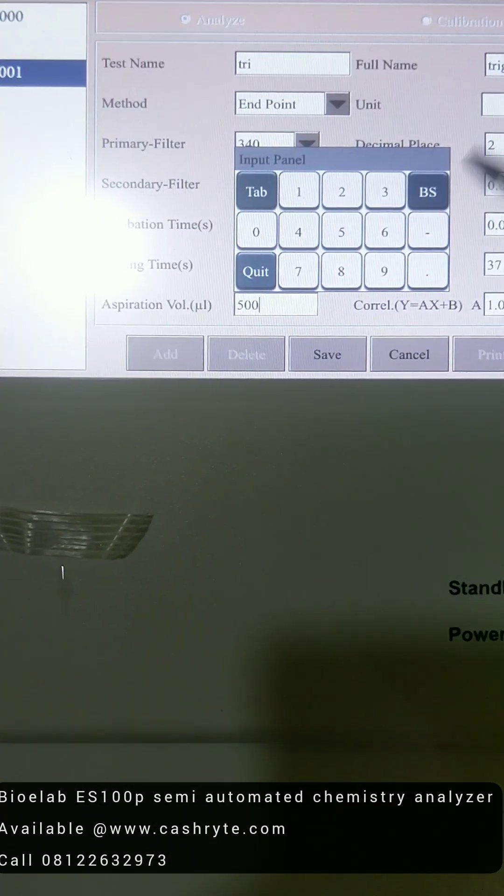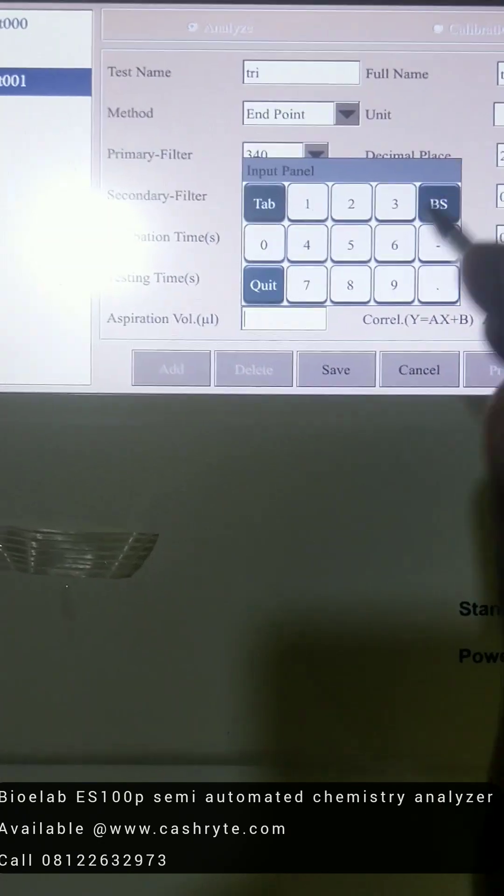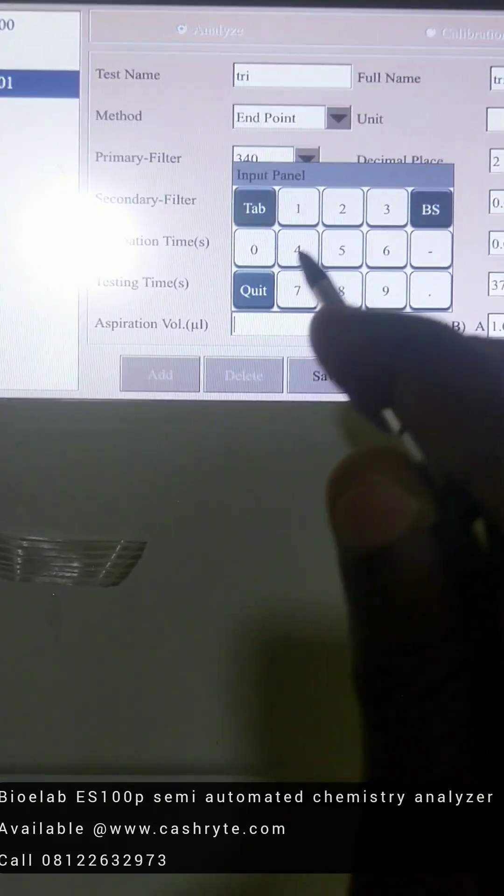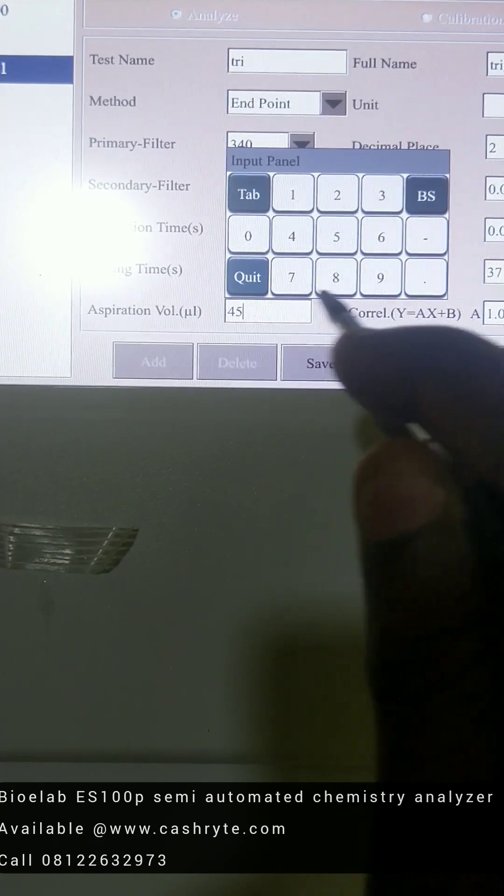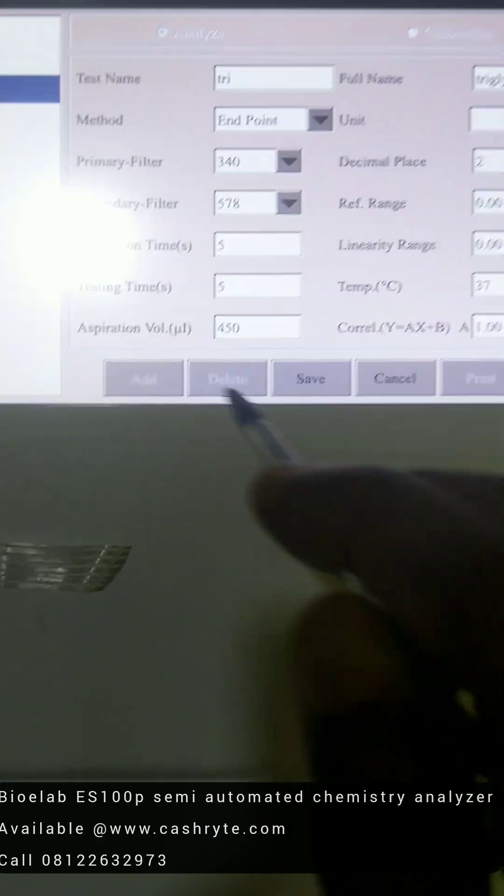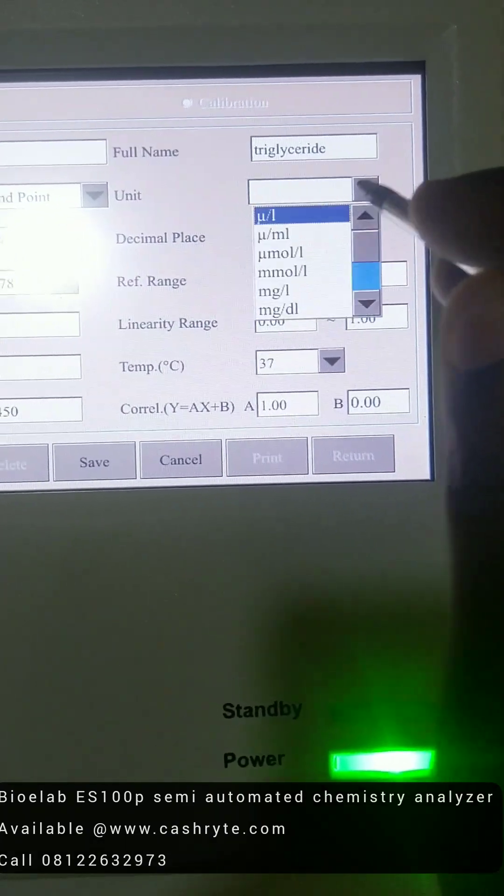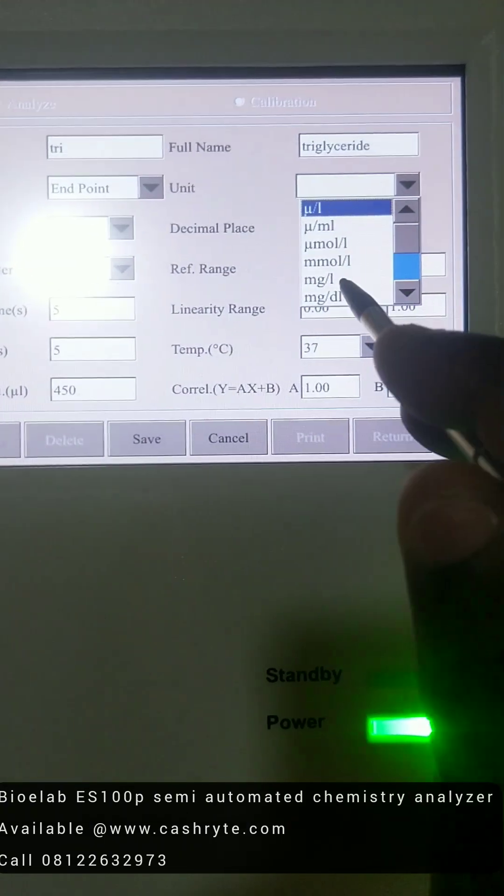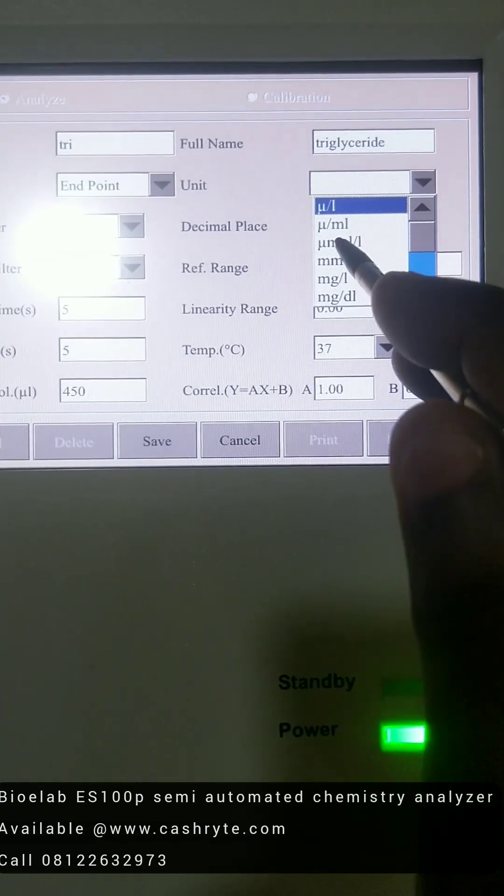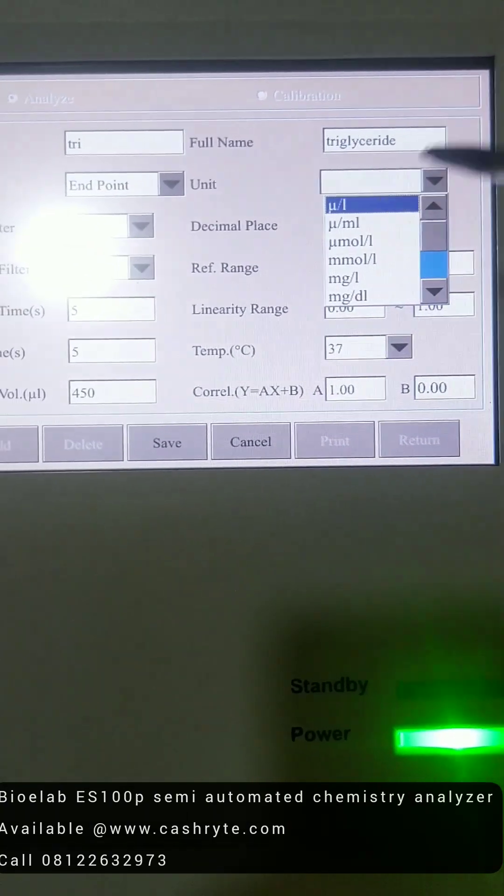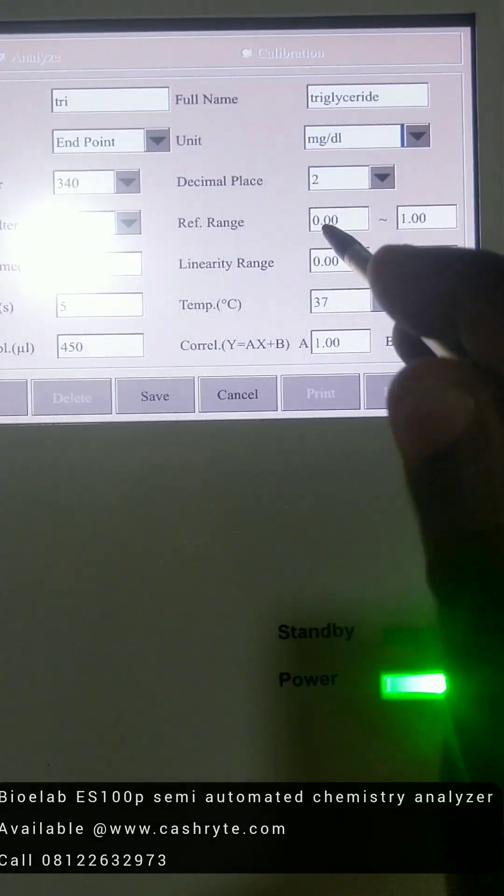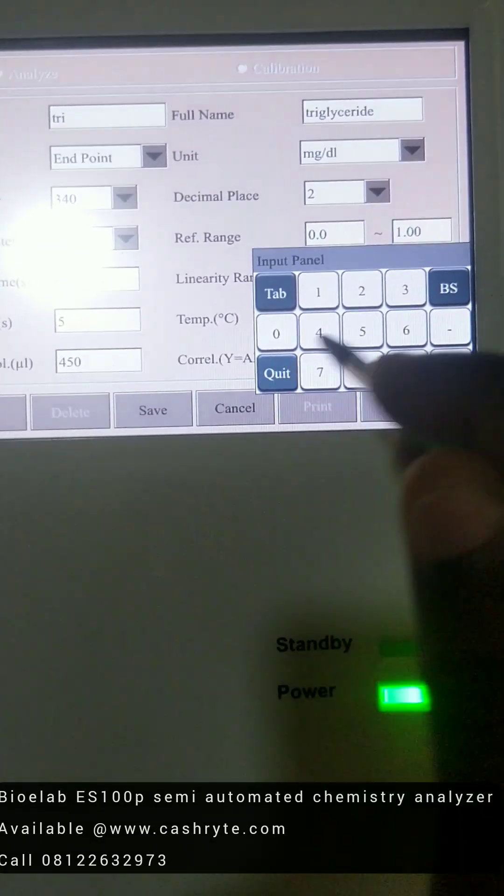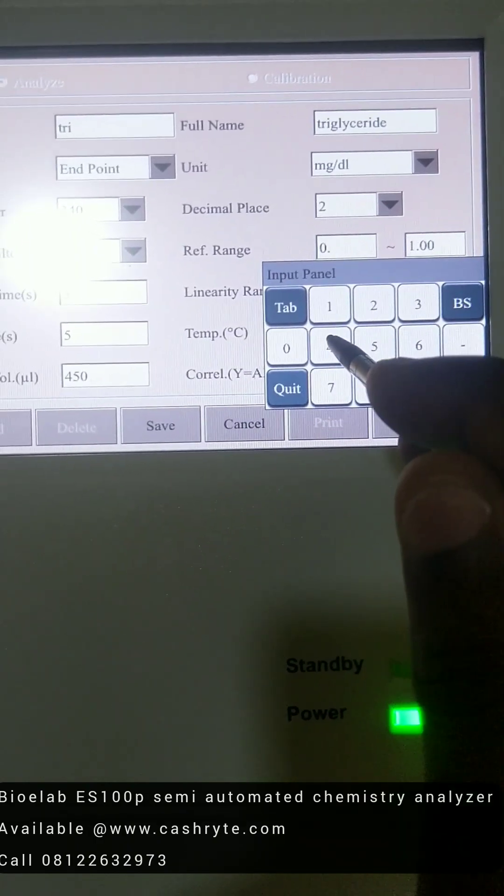Now you choose the volume of sample you want to aspirate. You can use 50. Then you set the units, depending on the units you want to use. Can be micromole per liter, milligram per liter, milligram per deciliter. So it depends what you want to use.